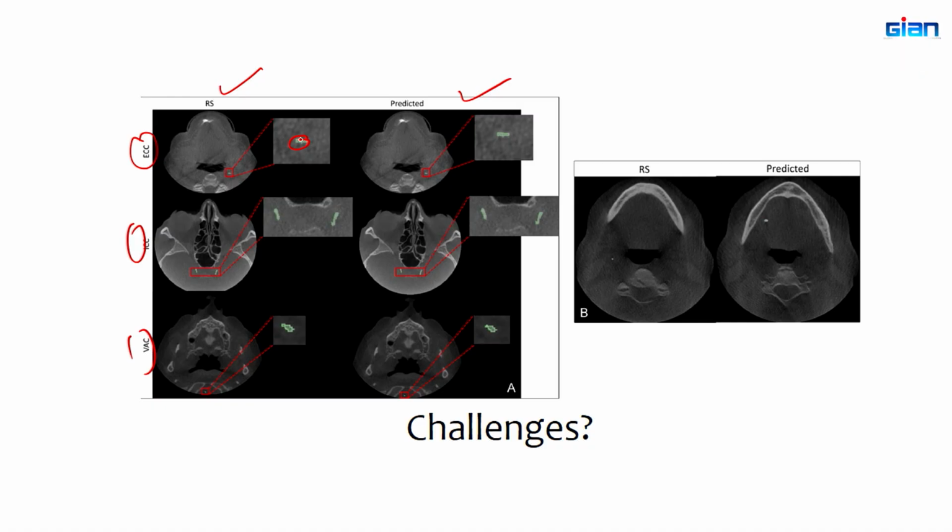Now this is very different from what you saw in the lung vessel work or with the brain tumor work, where the objects of interest were considerably larger. So it's probably a little bit easier for the segmentation models to segment those primitives as compared to this, and that is exactly what we saw here. Our segmentation performance wasn't that good.